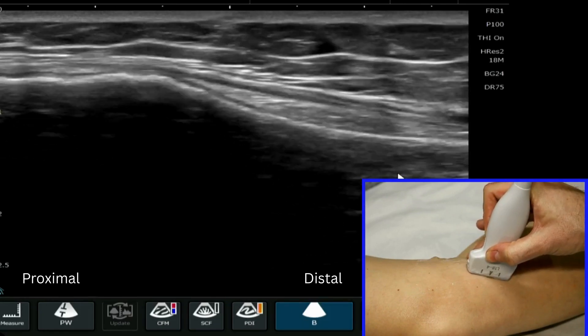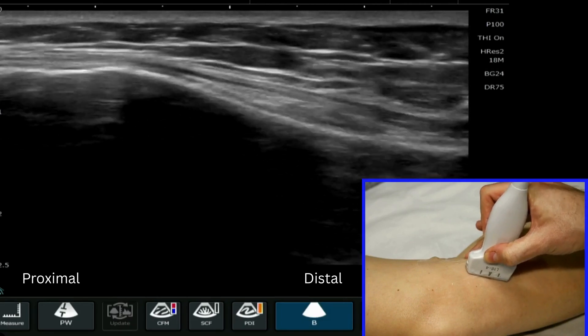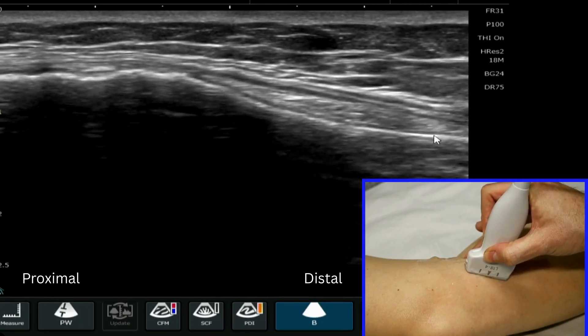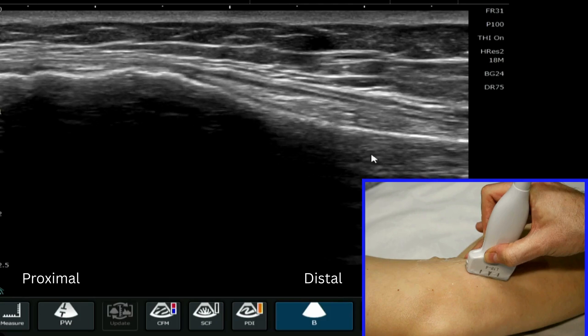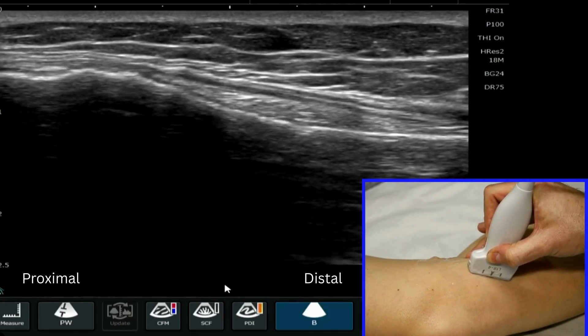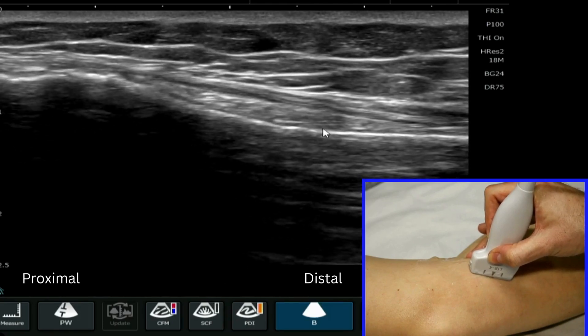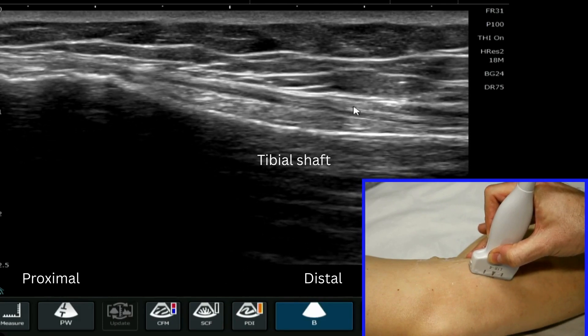We point the probe just slightly toward the tibial tuberosity and we will have here almost like a little viaduct appearance. We've got the inferior medial branches of the genicular artery and nerve just traversing here underneath the medial collateral ligament.